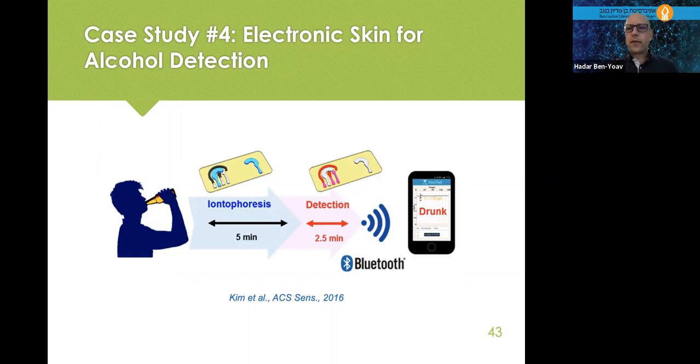And the problem here is that every one of us sweats differently. The sweat rate is different. Some sweat fast, some sweat slow. So the amount of sweat is different, and we need a way to generate a higher amount of sweat. And for that comes the iontophoresis. It's a method where you have two electrodes, both are the blue ones here, and you apply a very, very low current between the two electrodes. You don't feel it, and it causes the sweat pores to open and sweat comes out. So it allows sweating in the area of the detector.